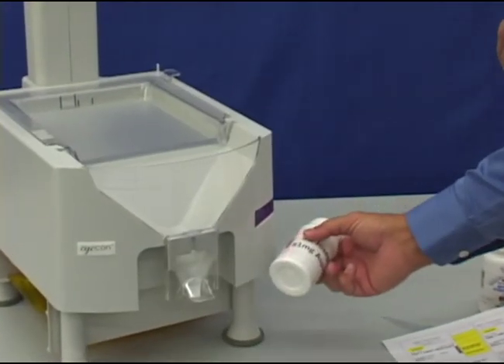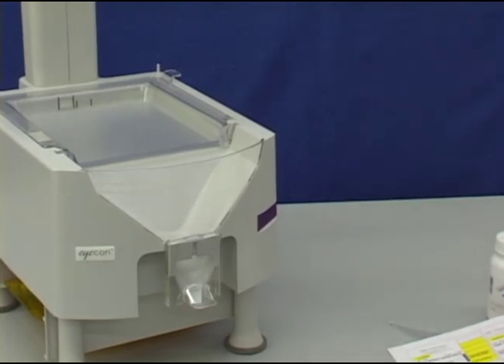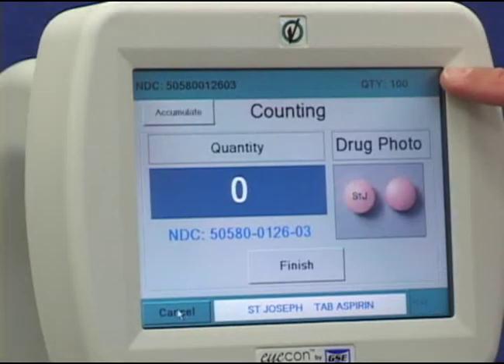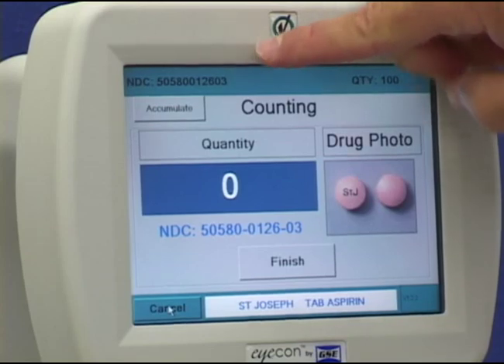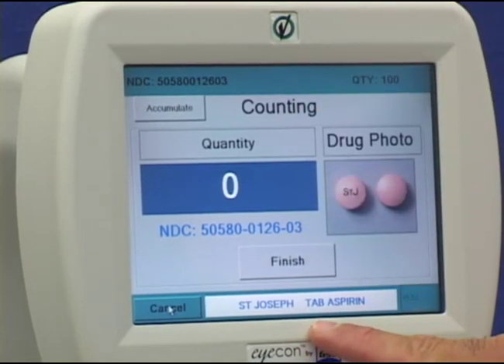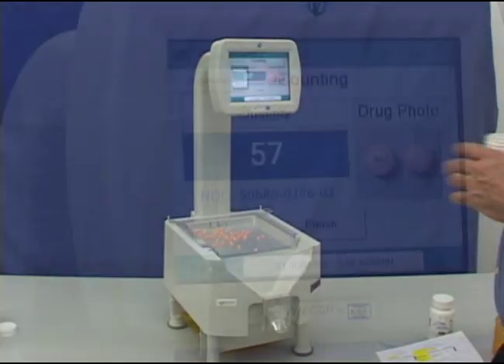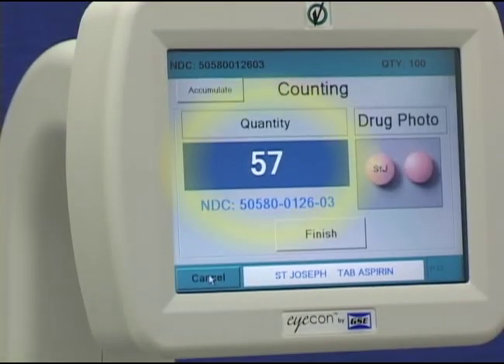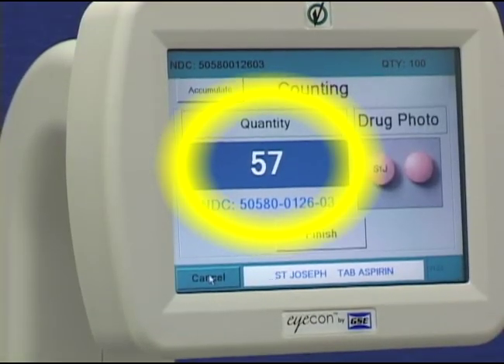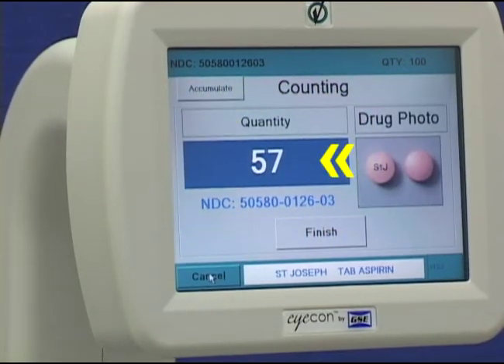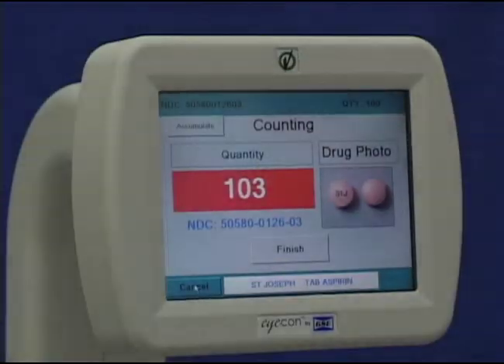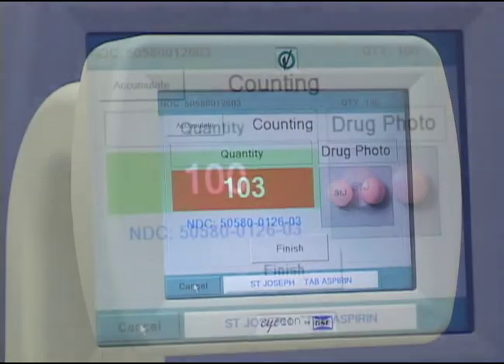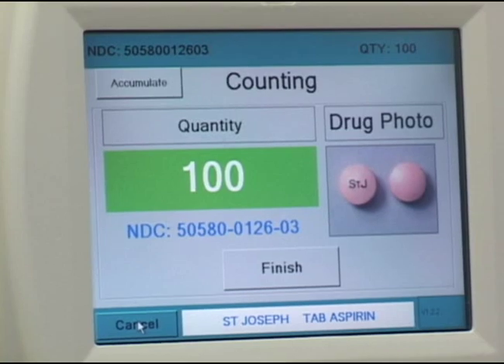Scan the stock bottle. The display still shows the quantity required for the script, the NDC number, and the name of the drug just scanned. Pour the pills onto the platter. Besides the displayed count, a blue background means there are not enough pills, a red background means too many, and green means just right.